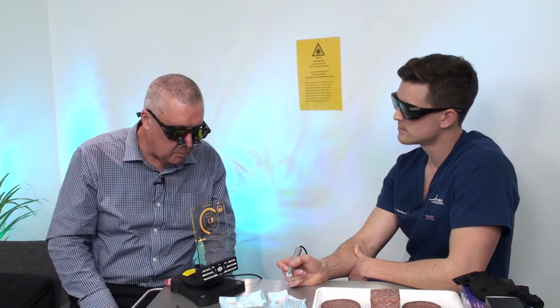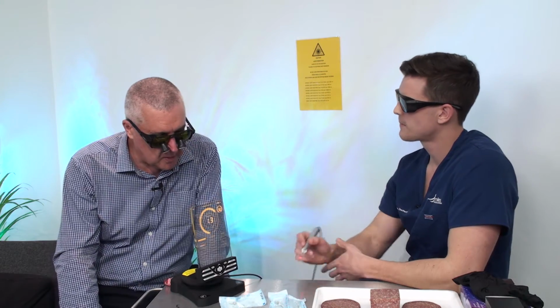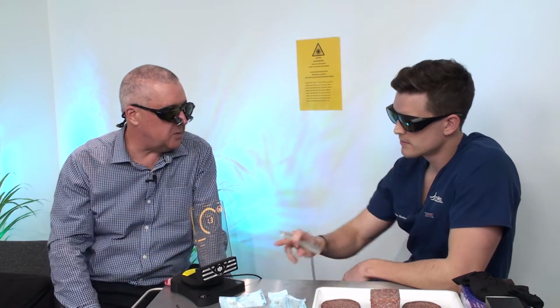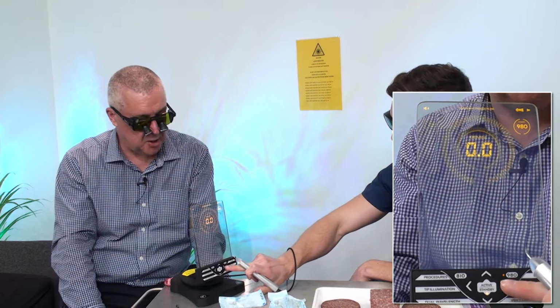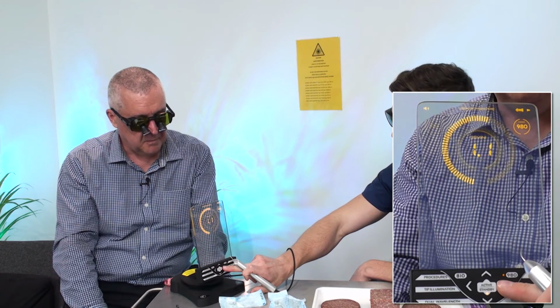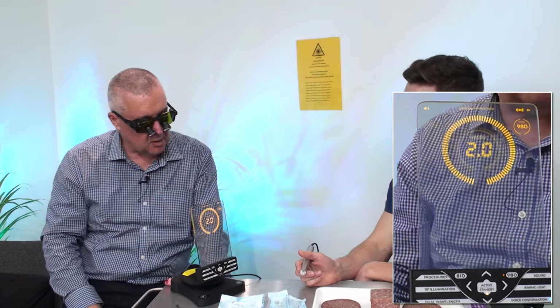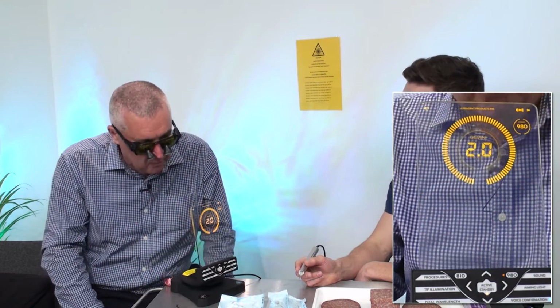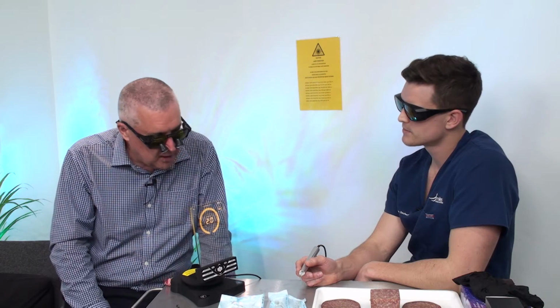Now, while the laser has a whole bunch of built-in settings, being a bit of an old guard guy, I'm notorious for not using them. So if you just hit the procedures button and turn that off, we can now actually just directly dial up the power by just touching the up or the sideways button. And I actually like this concept of just literally dialing up the power on the screen. It's a really quick way of getting to the maximum power of the laser, and actually saves a couple of button presses as well, which I think is really neat.